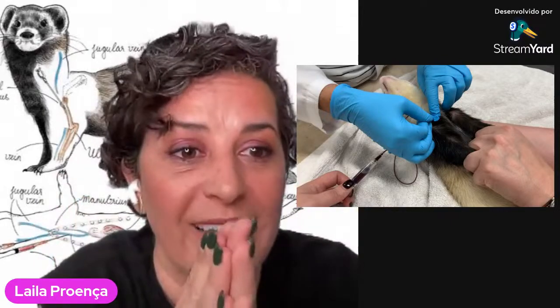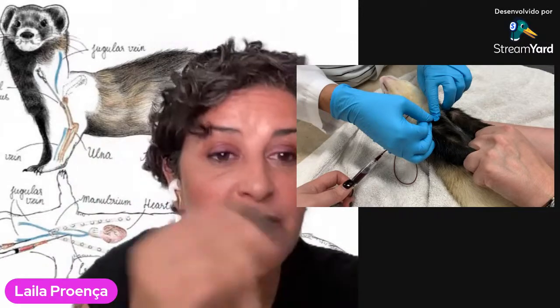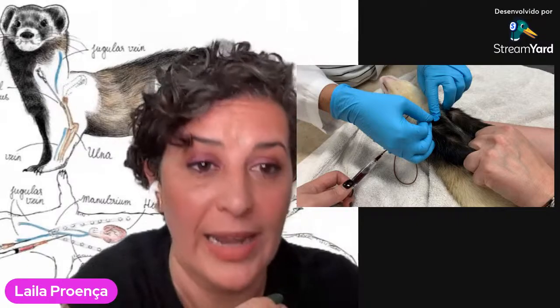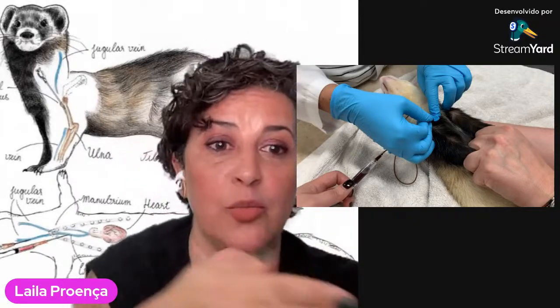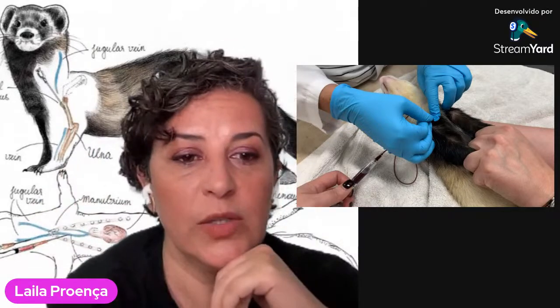Another very important thing, guys, please, I'm going to tell you a secret. And this time the camera is on and the microphone is on. Do not keep fishing. If you do the cranial vena cava, you cannot keep fishing and redirecting. You might lacerate it. If you can't hit it, you need to bring it all the way back and try again, okay? So that's what we do for ferrets.